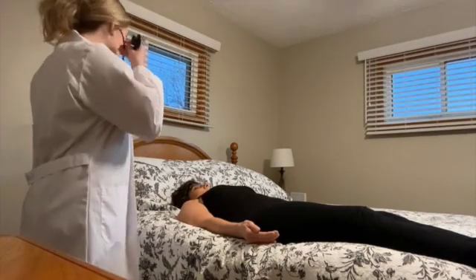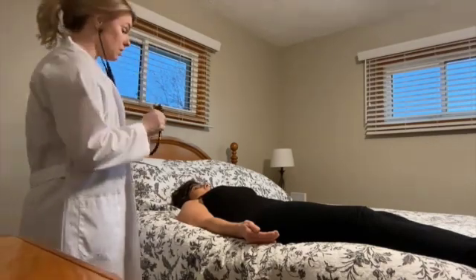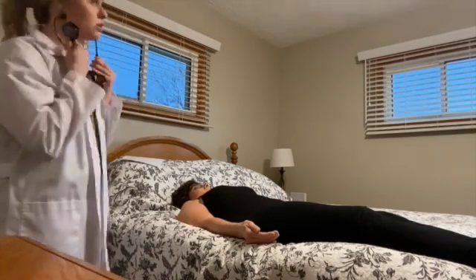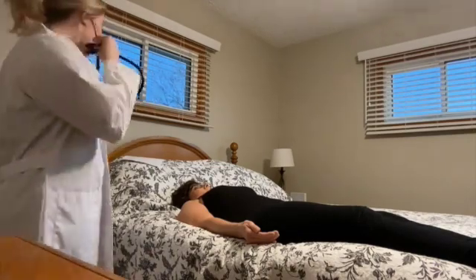And then I'm going to listen to those same 5 spots again, but I'm going to do it with the bell of my stethoscope, which will let me know if there are any murmurs.